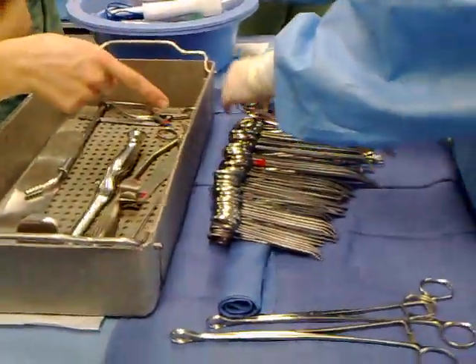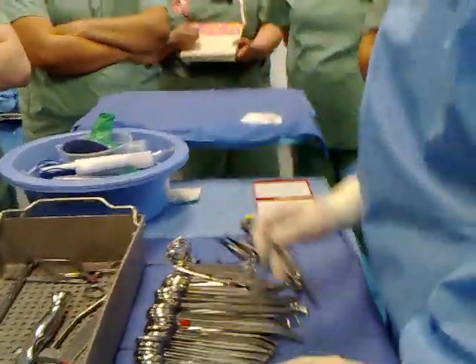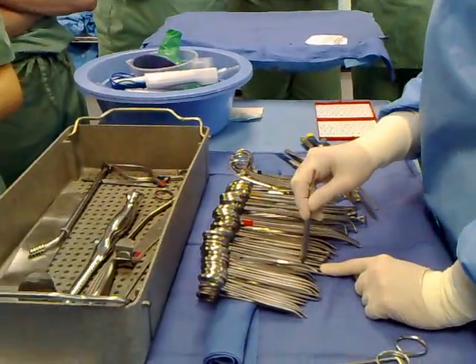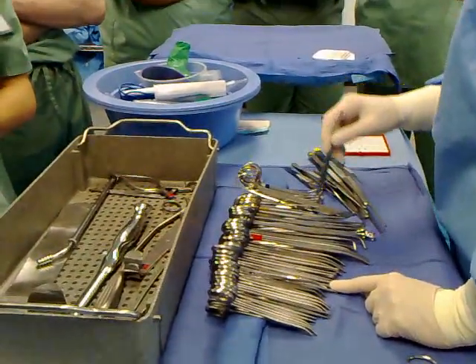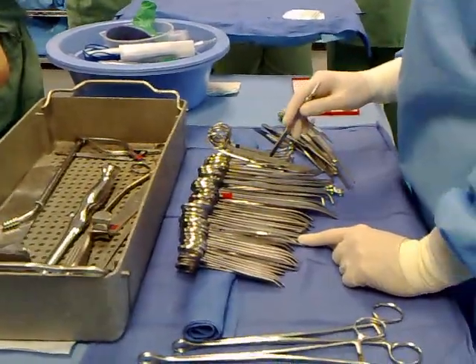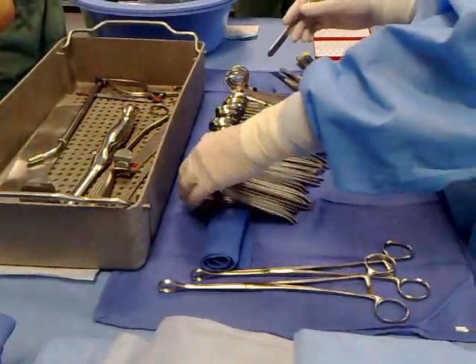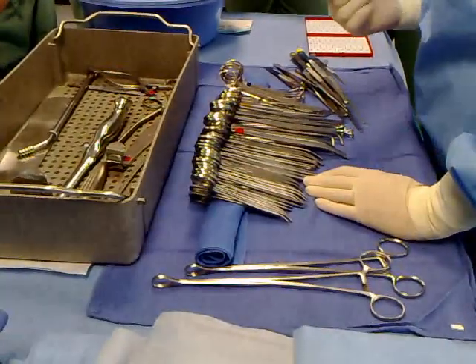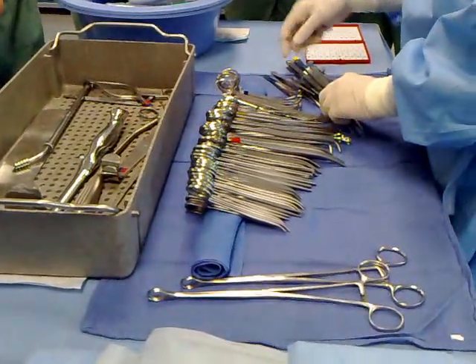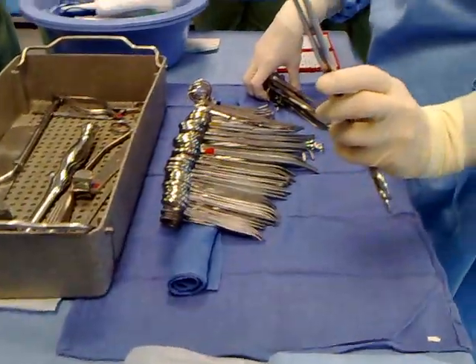Those are bigger Cokers over here. You mentioned your place does short and long separate. Where I'm from, Cokers were all together, Alice's were all together, Babcock's were all together — no matter the length. But here they're done separately, so we'll do it the way you guys do. And two Foresters.